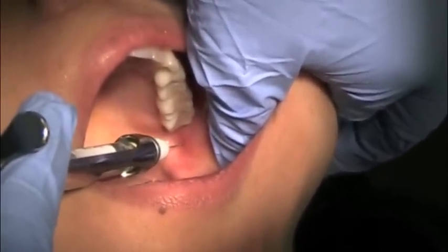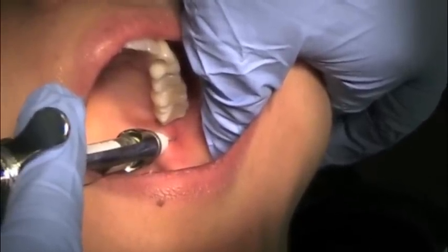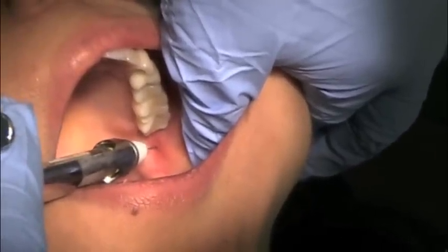Slowly advance the needle until osseous contact is achieved. Depth of insertion is about 25 mm. Aspirate twice by rotating.